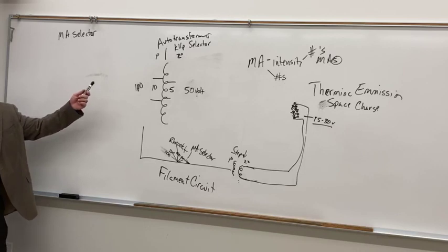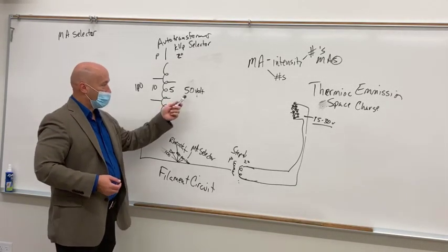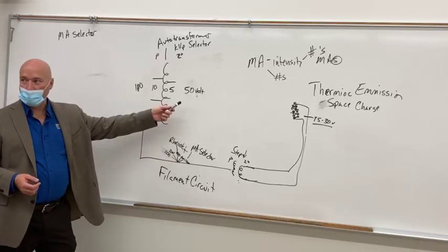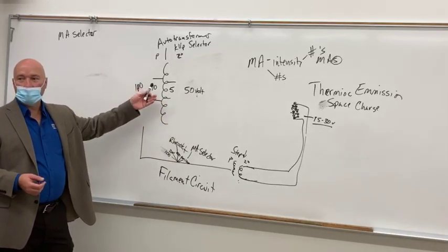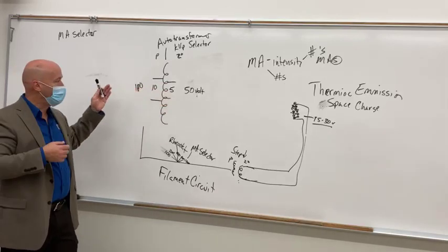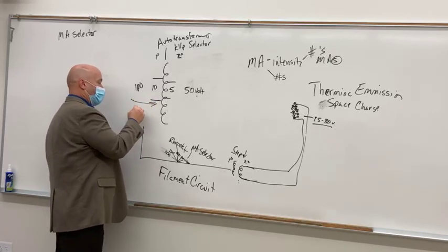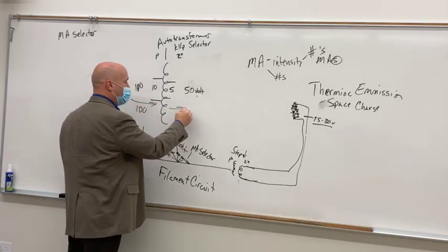In this case, 50, right? So are you actually setting 50 kVp? Not really. You're setting 50 volts, right? So that whenever you make your exposure, what comes in here is 100, and what goes out of there is 50.